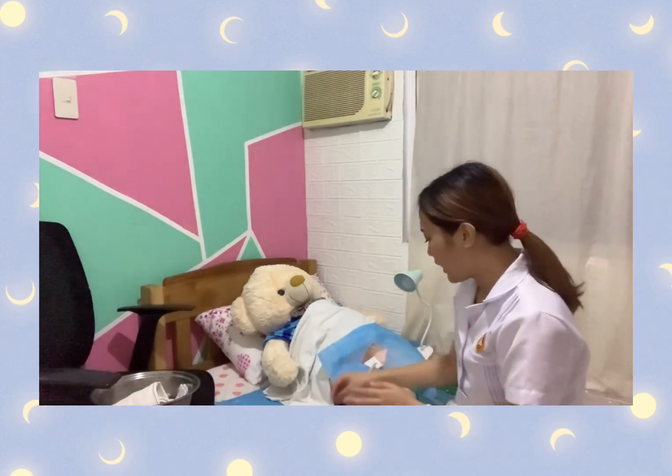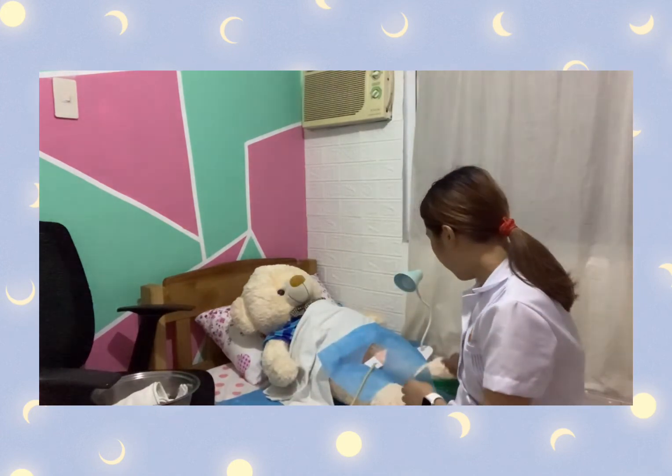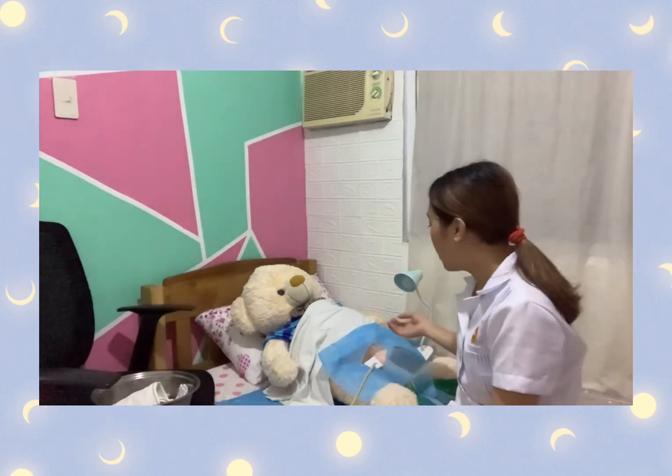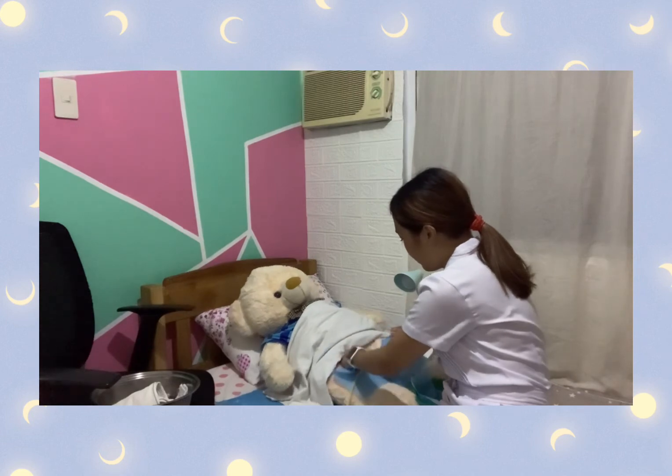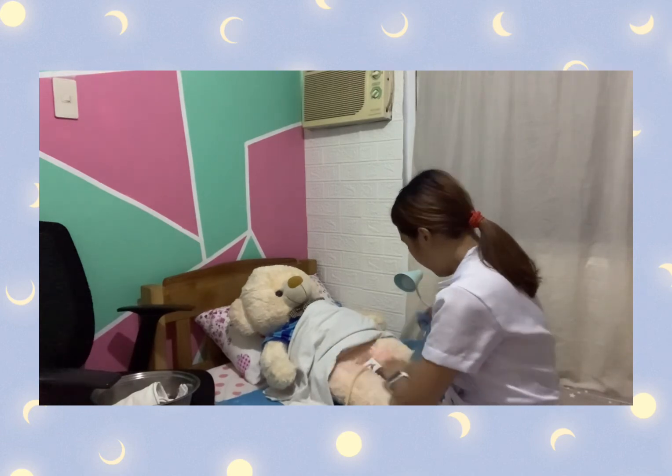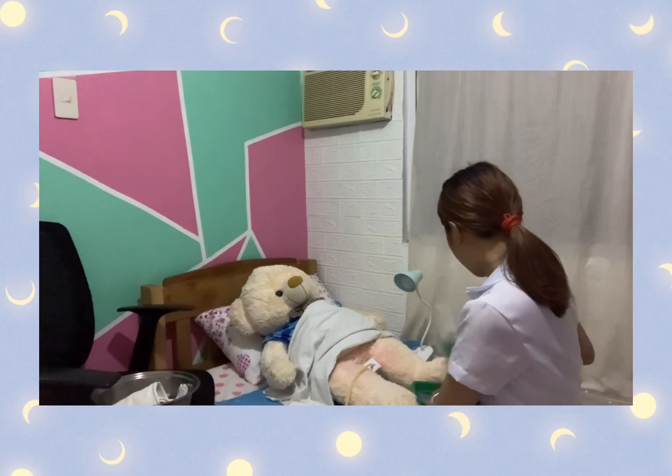After hanging it, we will now perform aftercare on the patient. We will now remove the drapes. And then after removing the drape, we will perform aftercare on all of the equipment that was used.